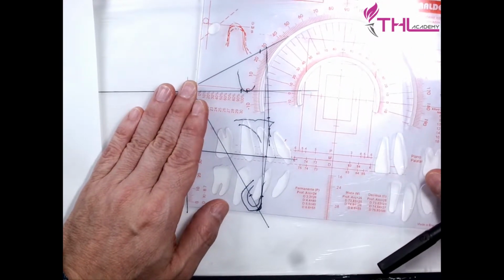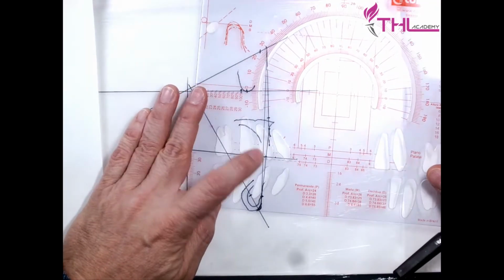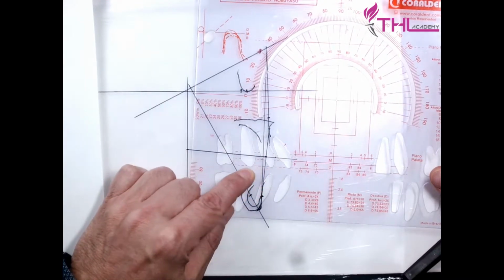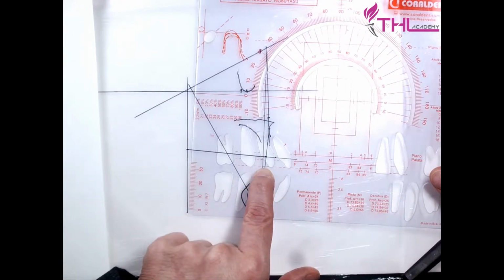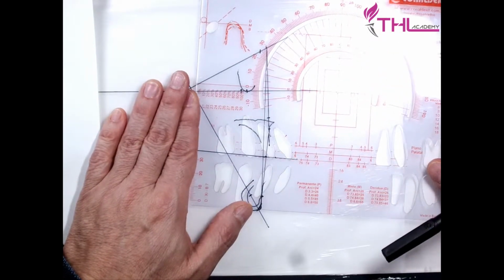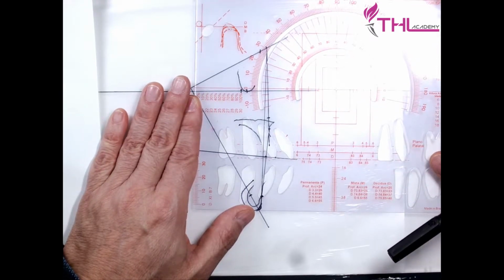Now in this template I can change or leave the inclination. Here is the normal inclination in an adult between these lines. These lines are occlusal planes. So what I do, I don't like too much of this. I can incline a little bit more because it's a young patient.